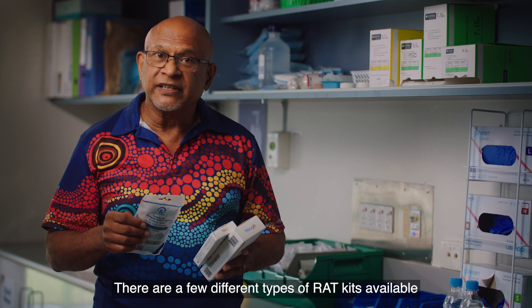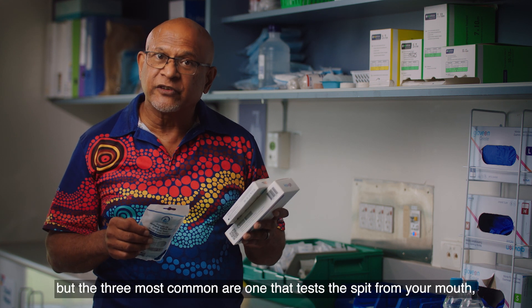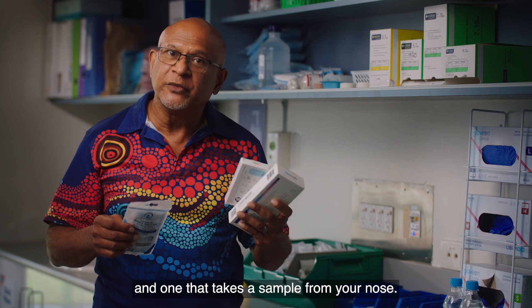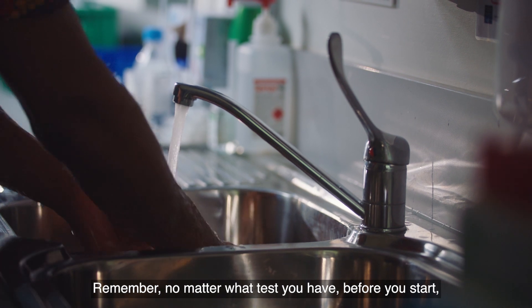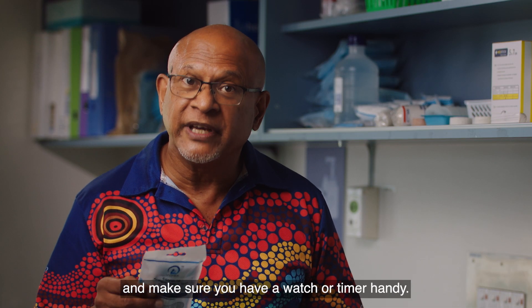There are a few different types of RAT kits available, but the three most common are one that tests the spit from your mouth, one that you suck like a lollipop, and one that takes a sample from your nose. Remember, no matter what test you have, before you start, wash your hands and make sure you have a watch or timer handy.